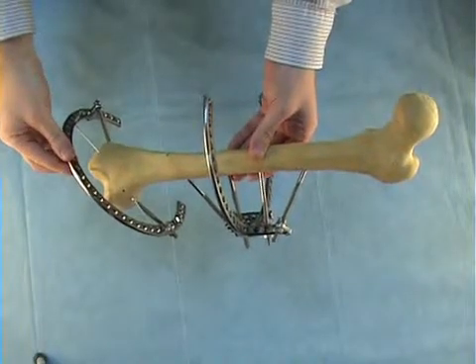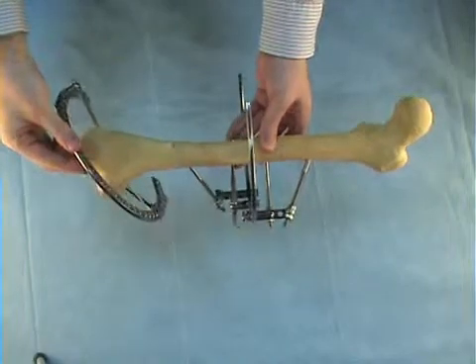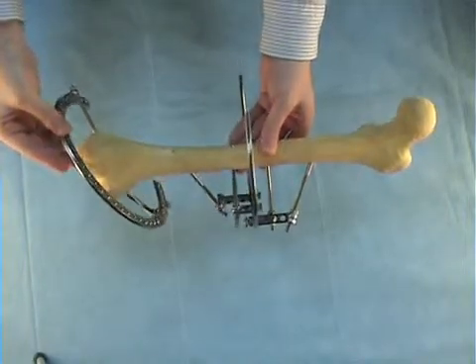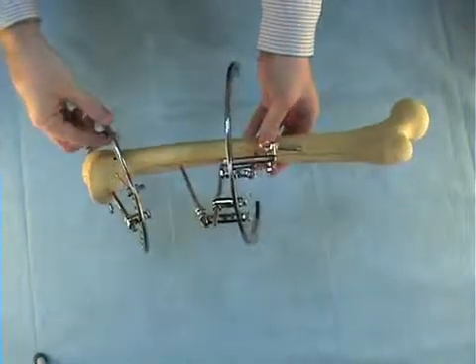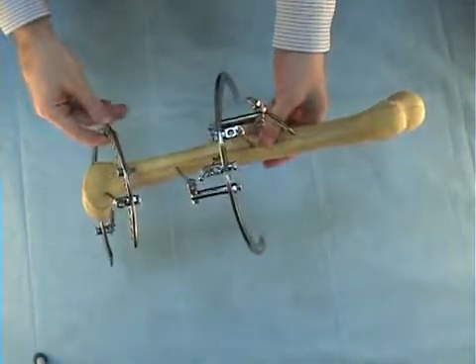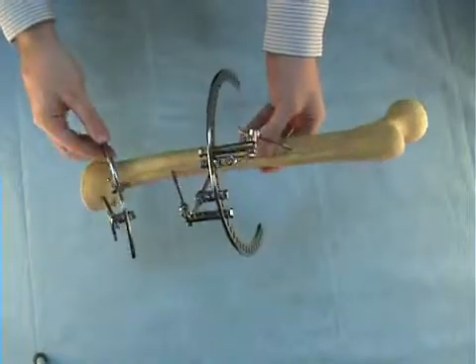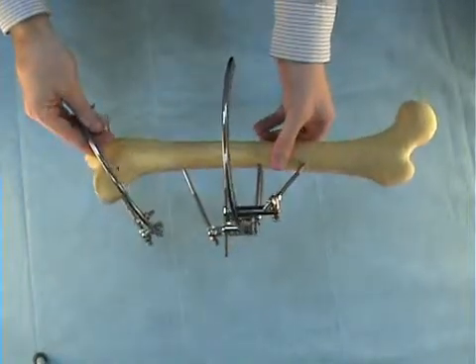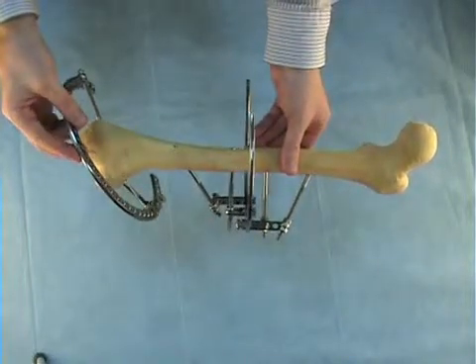We want to apply OrthoSUV frame at femur supracondylar deformity. We have preassembled the rings and inserted the half pins and wires specially for this deformity. This is a classical assembly of rings and transosseous elements for supracondylar deformity of the femur.